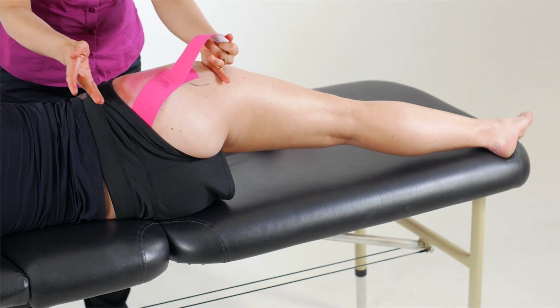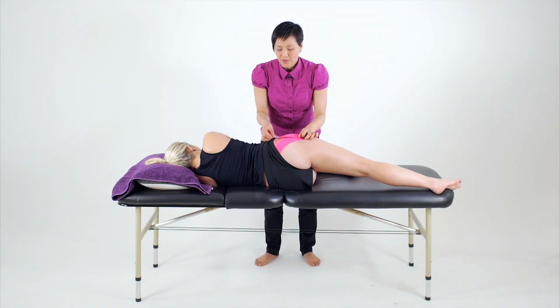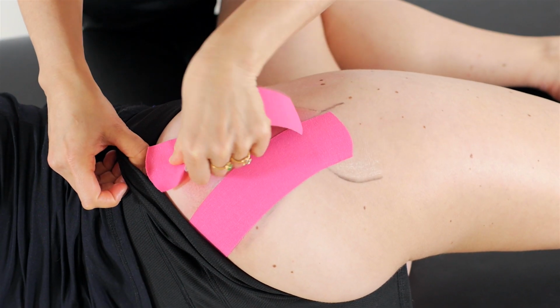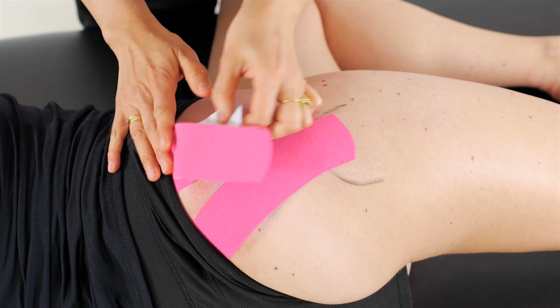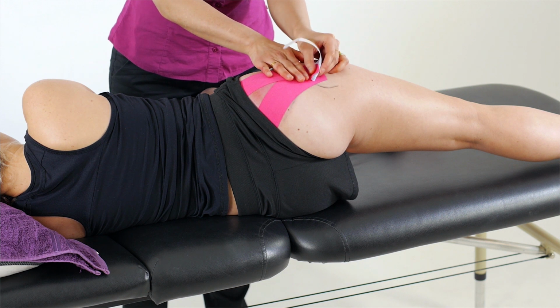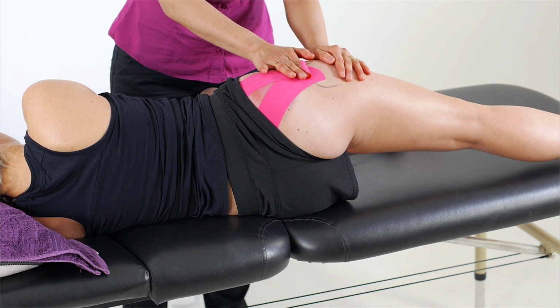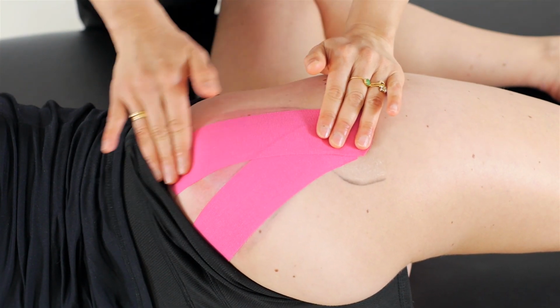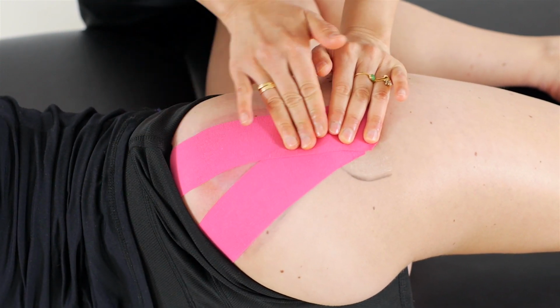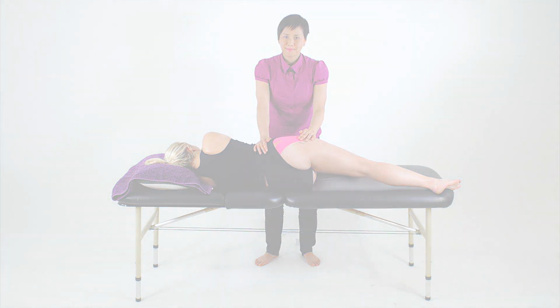Again, we measure a length of tape from the ilium, so more anterior this time, to the greater trochanter. So we'll remove the tape off the backing, let it settle to 0 tension before placing it on the ilium to cover both the anterior fibers of glute med as well as the gluteus minimus. Pull the tape back to the final anchor and stretch that out with 25 to 35% tension before rolling the tape off the backing, let it settle to 0, and then place that anchor onto the anterior side of the greater trochanter. Rub the tape to activate the glue, and once more we'll retest the muscle for improvements and changes in strength, as well as any functional changes.